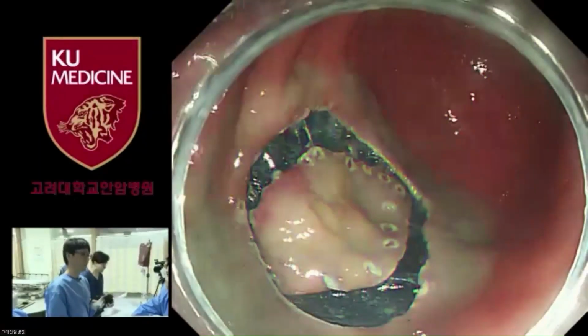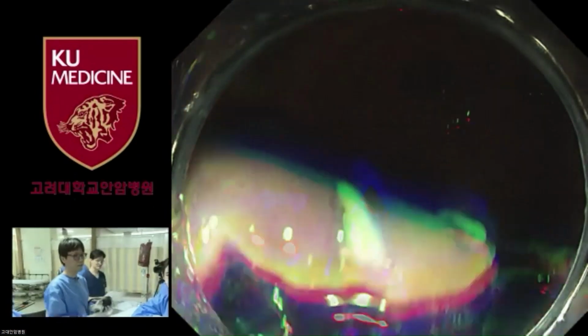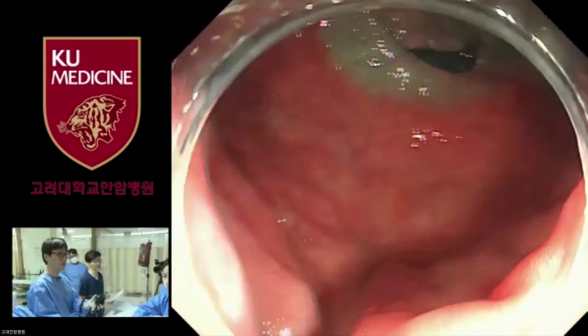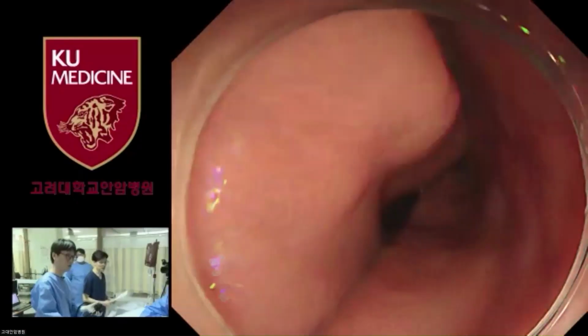I'm not sure that you need a robot. You are so fast. Yes, they can use another robot-assisted endoscope, but we are really waiting for your robot. Okay, I exchange my endoscope with the robotic system. Actually, this lesion is not in a difficult location, but today is a live demonstration with a limitation of time, so we just chose an appropriate location to show you.